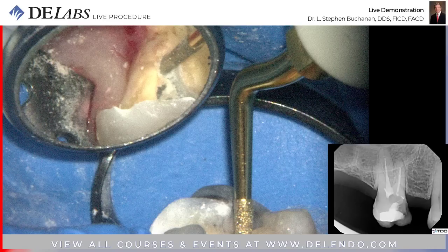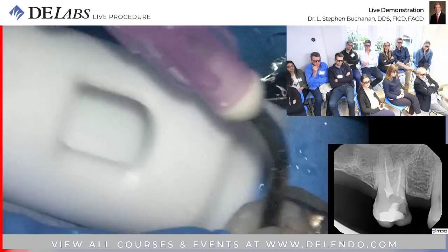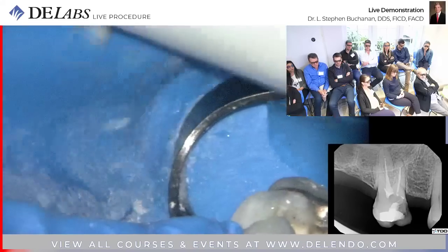Yeah, I wouldn't do molars without an ultrasonic. So for you that are employees in dental practices, don't tell them I said so, but you might want to go on strike until you get the tools you need. You need magnification and you need light. You need ultrasonics.